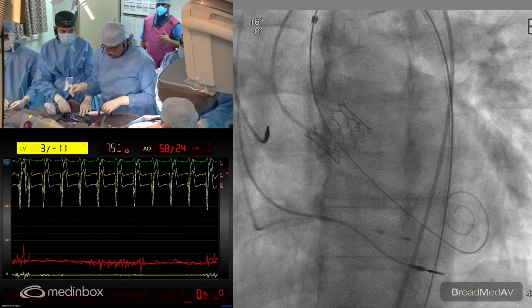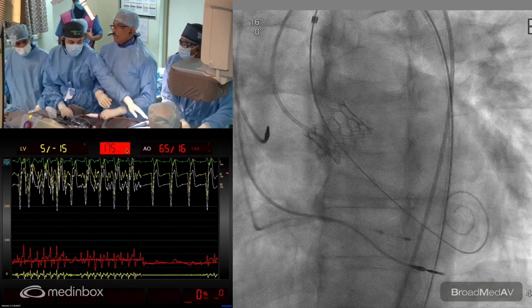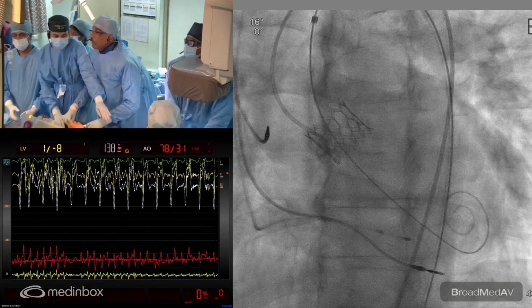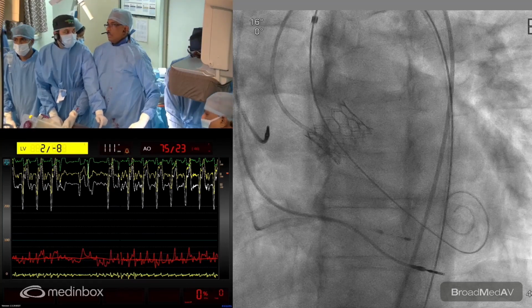Just a massage for a minute. Table down, yeah, just a minute. No problem. It will be settled. Just check the echo, please. Okay. Let's wait, just to see. How is the pressure? No pressures.